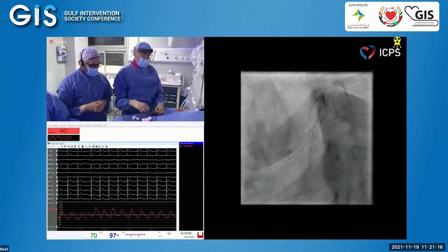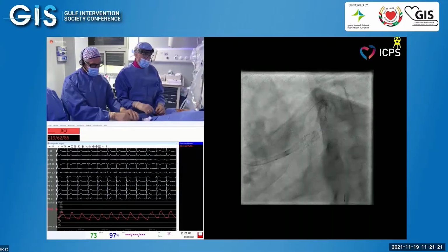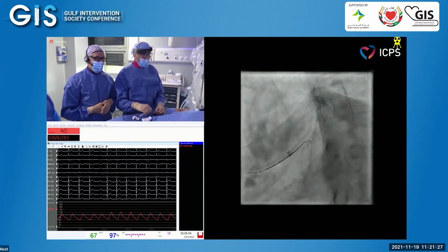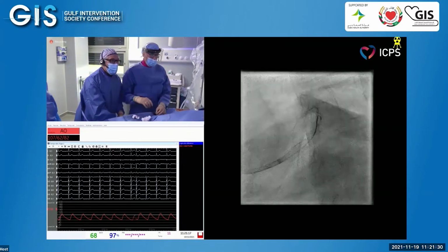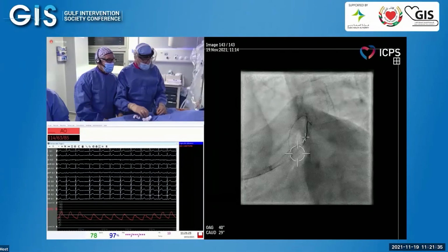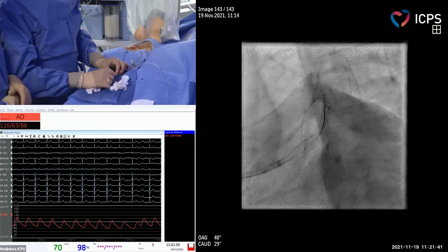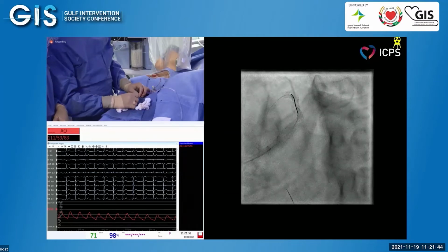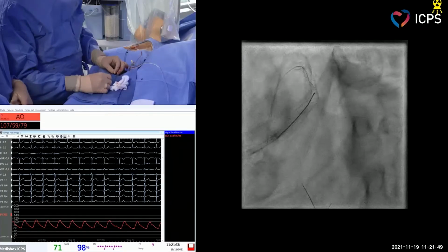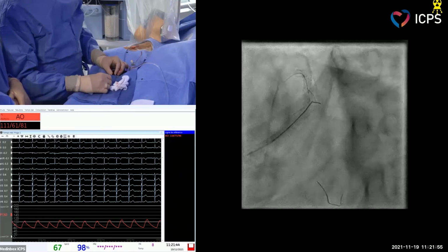If you have imaging on the table, do you rely on stent boost or? Yeah, we are lucky. Most of the well-equipped cath labs we have stent boost, and it's very fast. But if you wanted to make sure about the apposition of the stent, and you want to confirm that you did a great job, I think intravascular ultrasound will be again fast, and you will have a good result. Yeah, I think as we use already the OFDI, it would be a shame not to use it.